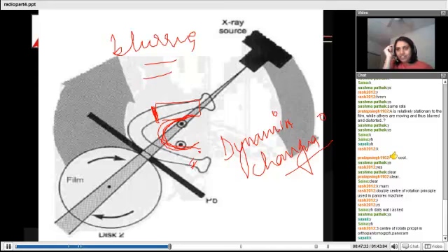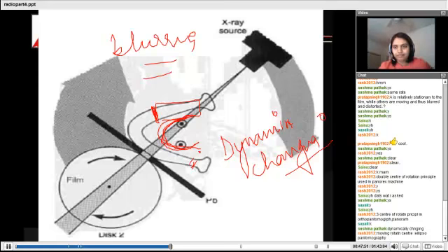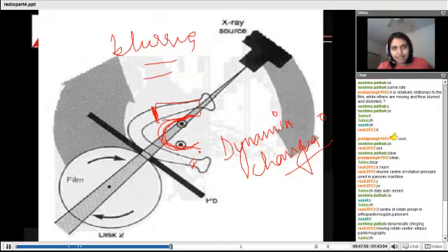If suddenly the center of rotation was changing, at that particular time you were noticing that blurring in that zone, isn't it? Now when it is dynamically changing, every adjacent point is getting focused every time the recording is happening. Yeah, moving rotation center, right? So hopefully that makes things clear about the center of rotation.